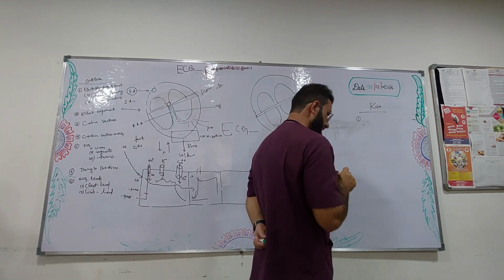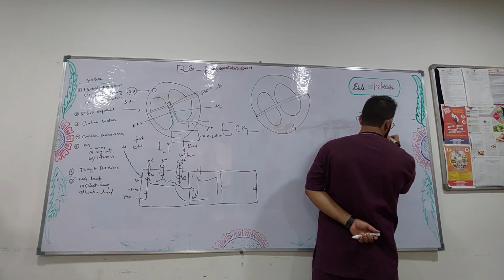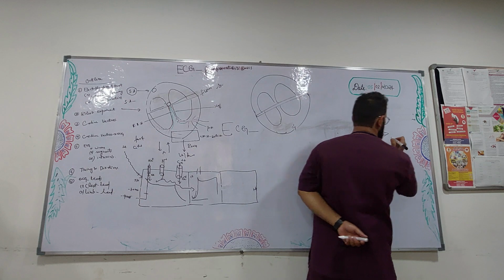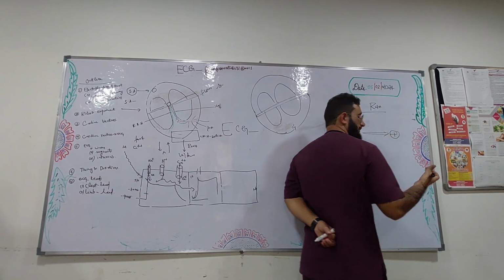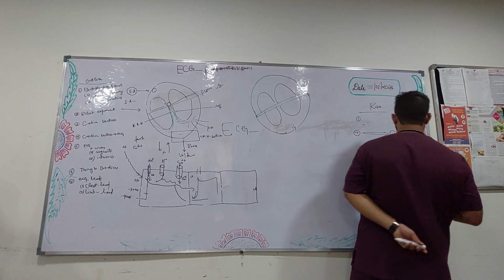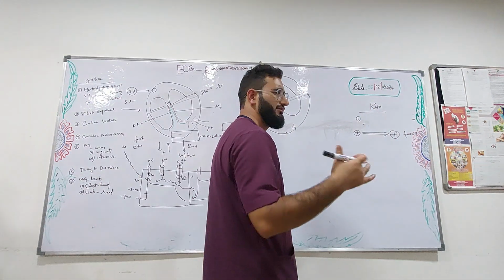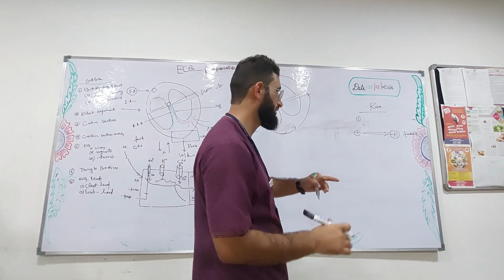Whenever there is direction of a positive charge towards the positive terminal of a galvanometer, or any positive terminal. We have two terminals, a negative terminal and a positive terminal.